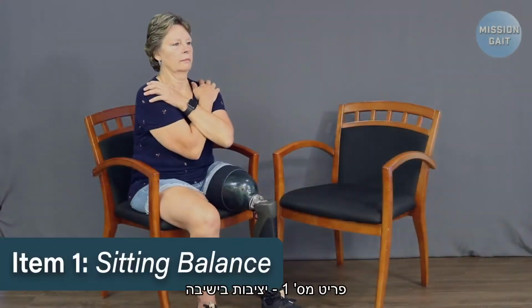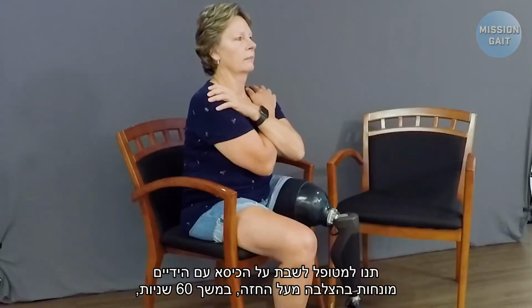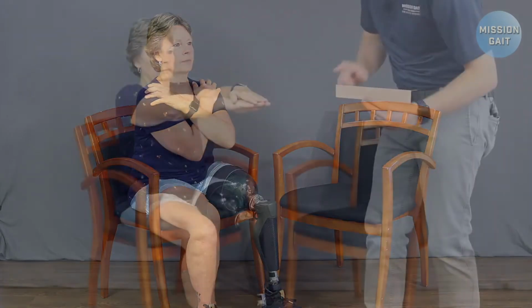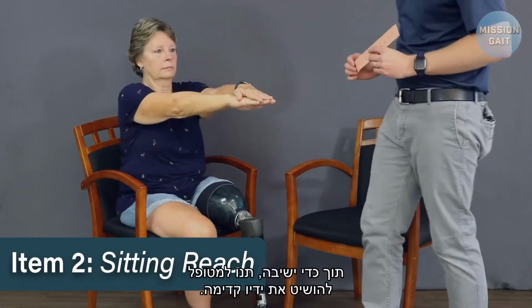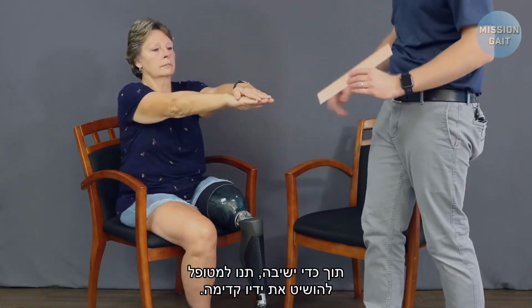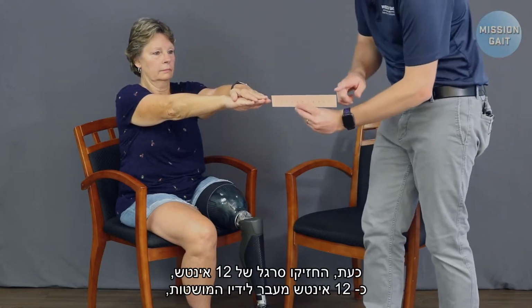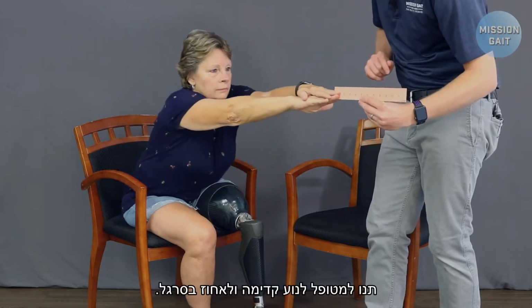Item 1. Sitting balance. Have the patient sit in a chair with arms folded across the chest for 60 seconds. Score as indicated. Item 2. Sitting reach. While sitting, have the patient extend their arms forward, and then hold a 12-inch ruler about 12 inches beyond their extended arms. Have the patient reach forward and grasp the ruler.